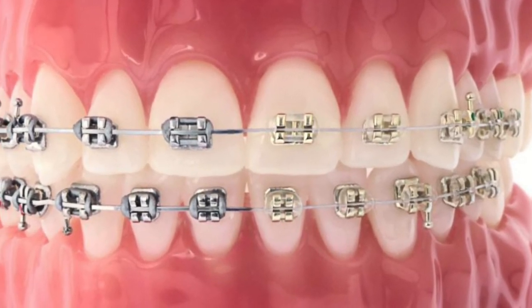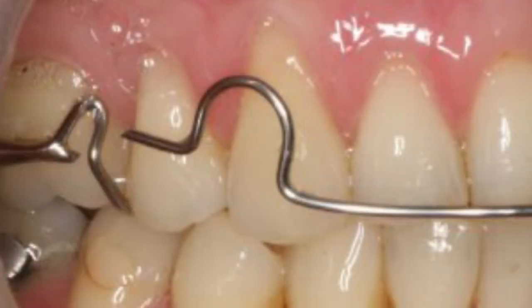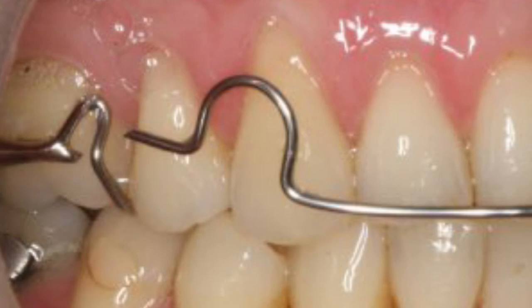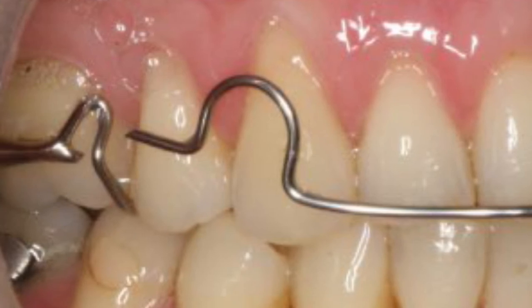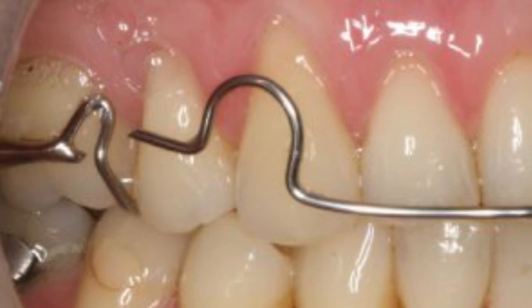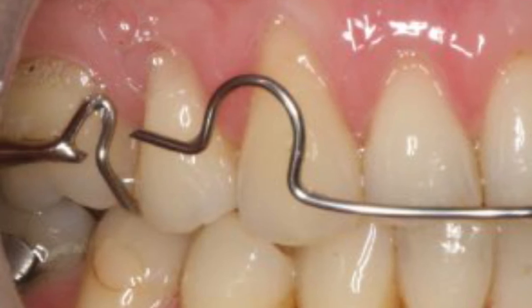One last thing worth mentioning is that some patients get tempted to flick the brace in and out with their tongue. Definitely try and avoid doing this, because the clasps or clips that hold it in place tend to weaken and eventually snap if this is done repeatedly.